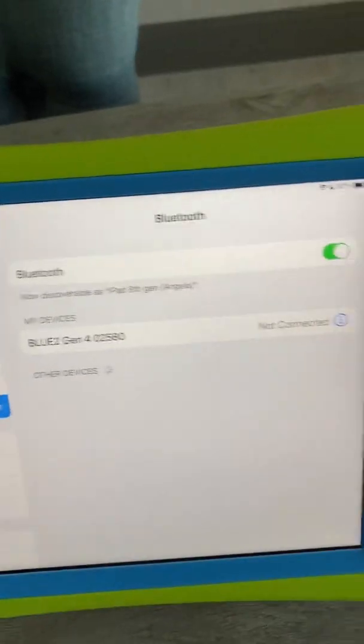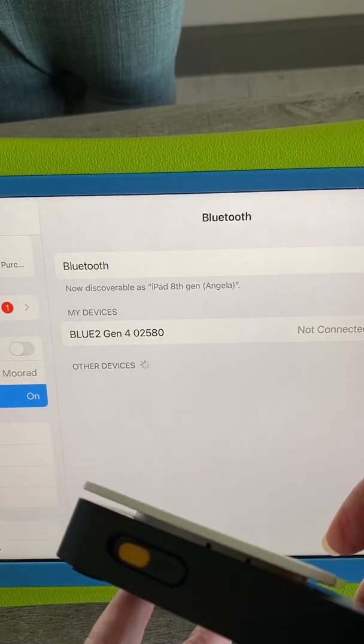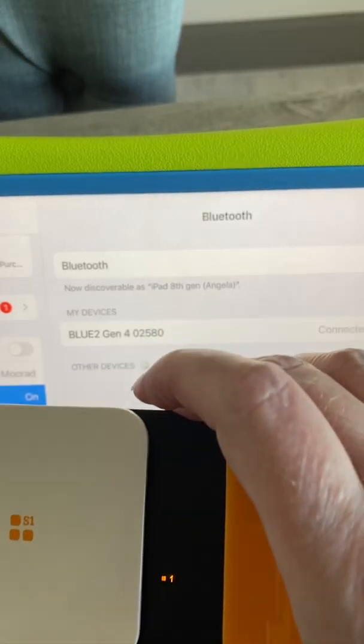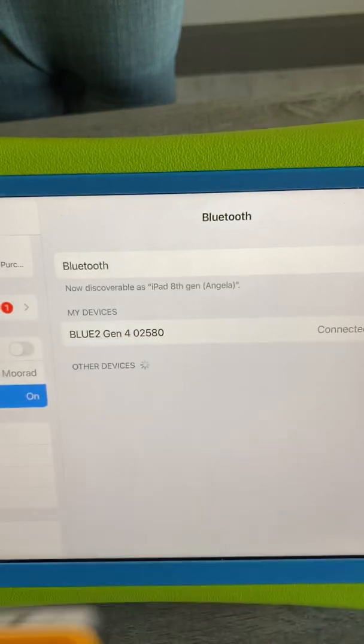I need to make sure that it's turned on, and a critical piece here is that it needs to be in mode one — so that one lit up.